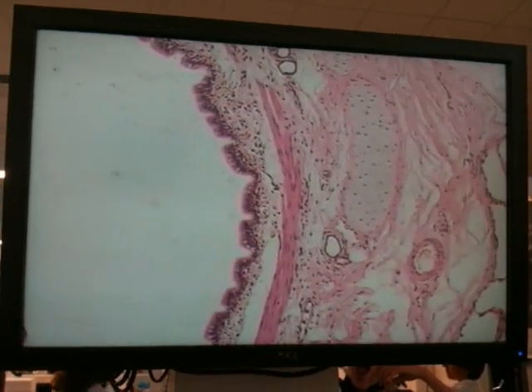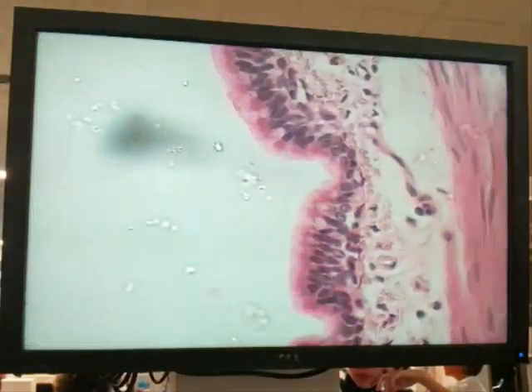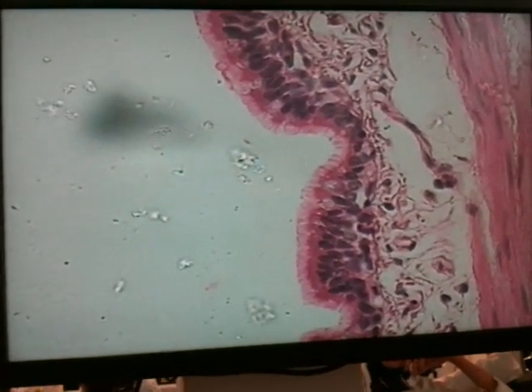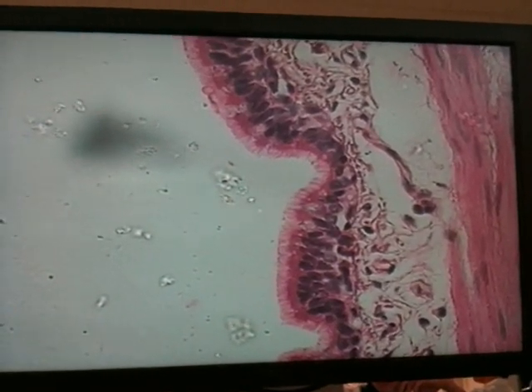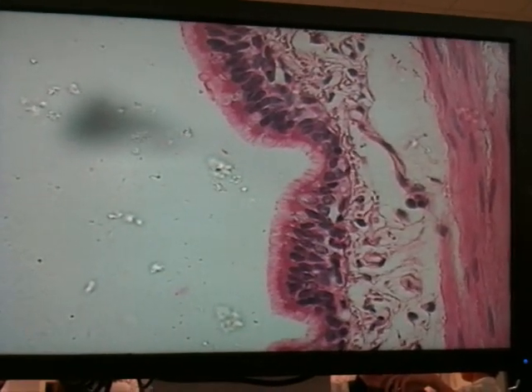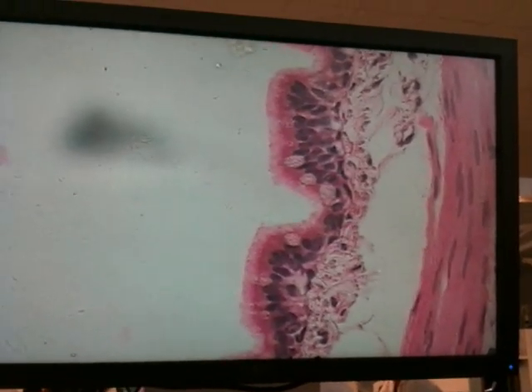If we go to high power, just have a look at the mucosa. We've got a nice pseudostratified ciliated epithelium. You can see a nice light border where all the cilia are sticking up into the lumen of the bronchus. You can't see that many goblet cells as easily here. This particular slide is not PAS stained, so we're not looking for bright pink goblet cells, but there we can see some nice pale goblet cells in the mucosa.